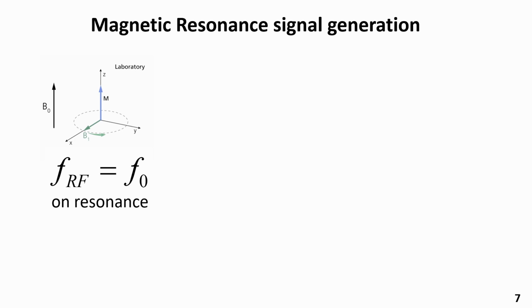This RF pulse is tuned on purpose to the same frequency that the spins spin. It is applied so that it's on resonance to the Larmor frequency. Remember that the job of every spin is to spin about any magnetic field it experiences. The net magnetization vector M now has to spin about the 1.5 Tesla field and about the RF pulse. Here you see the trajectory of the combined spinning motions. The net magnetization vector is forced to come onto the XY plane.